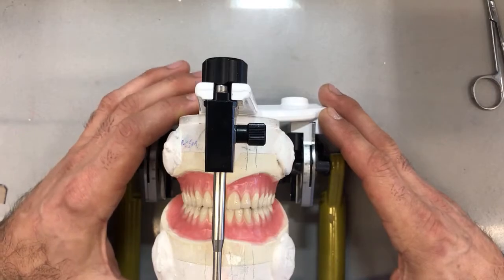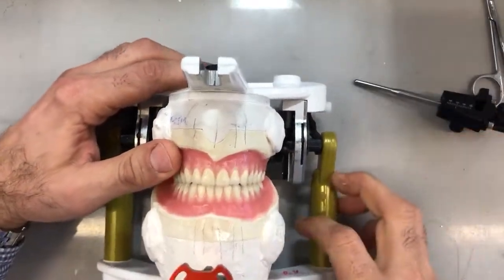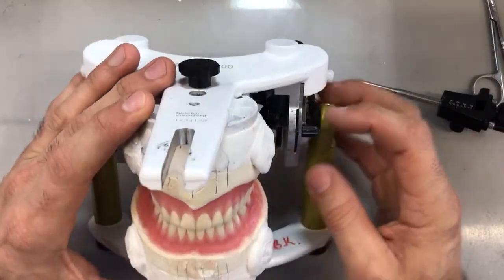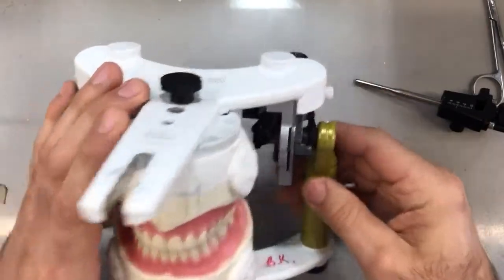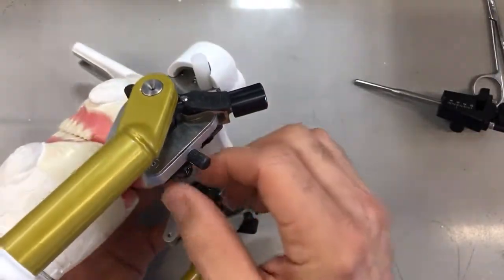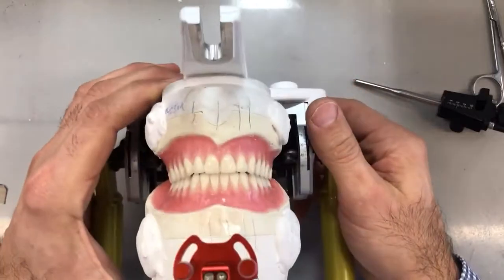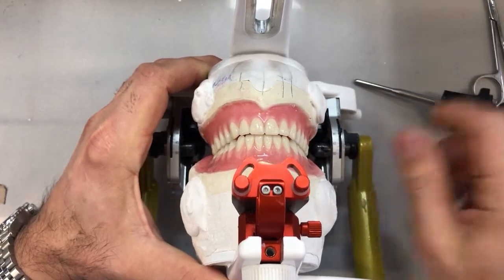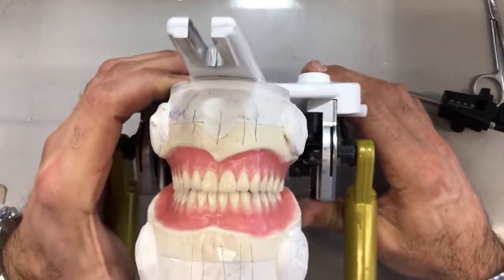We're going to move on to the next step: equilibrating the case through selective grinding and lateral excursions. First, I want to make sure that our condylar inclination is still at 25 degrees, as set before, on each side. The Bennett angle is at 15 degrees, and everything is nice and snug on the back of the articulator. At this point, I'm just going to visually assess the case to see how everything balances before we do any selective grinding.